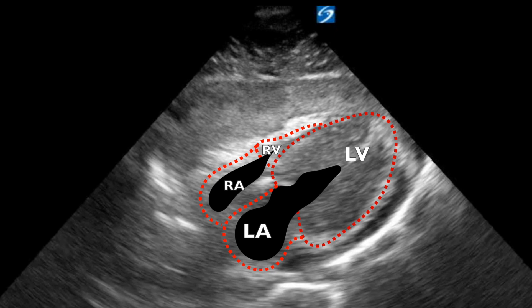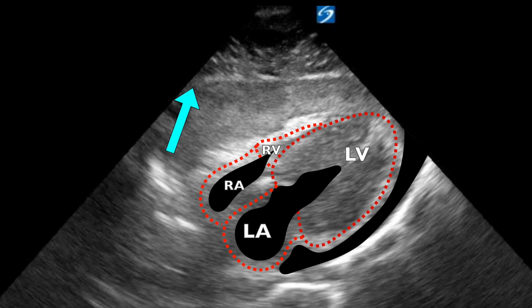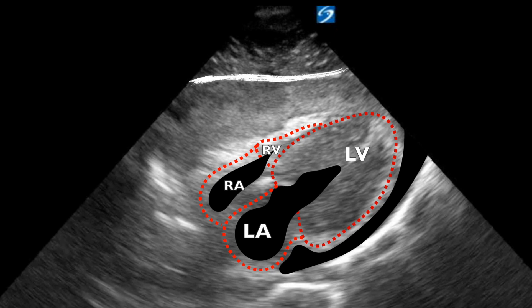Now here's where it gets a little bit difficult. We have the heart identified, and we start to interpret what's going on around it. Posteriorly we can see an effusion — I've drawn that in black so you can better appreciate where it is in relation to the heart. That's around the left ventricle. We can also see the pericardium up here, which can throw a lot of people off. That line is the pericardial sac, and above that pericardium — since we're doing a sub-xiphoid approach typical in resuscitation — that's going to be liver.